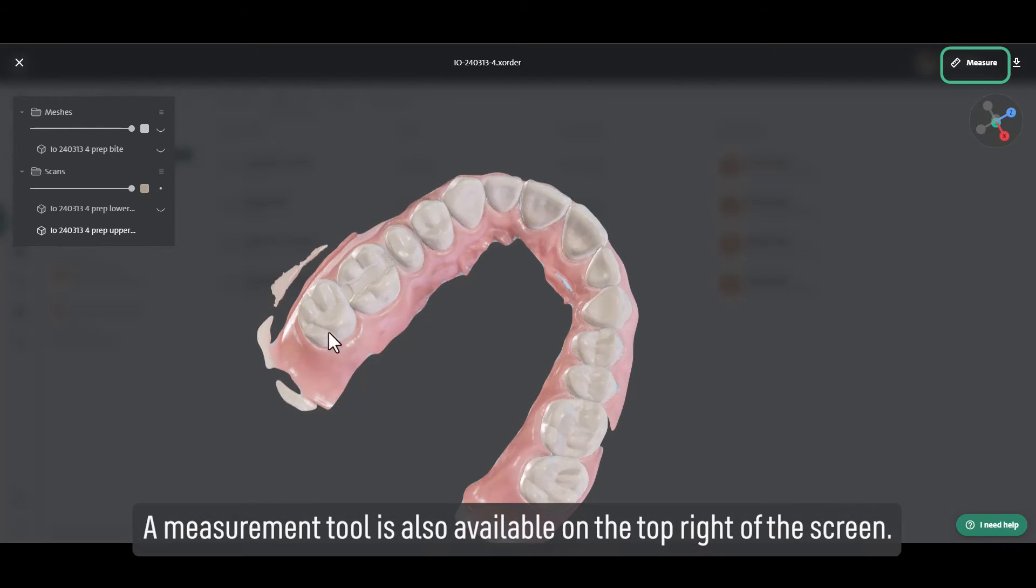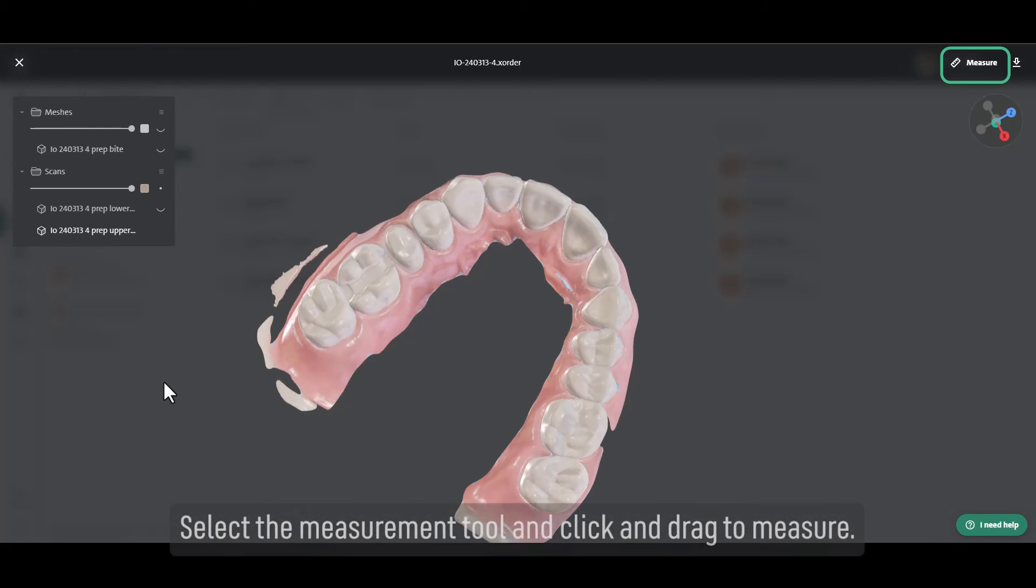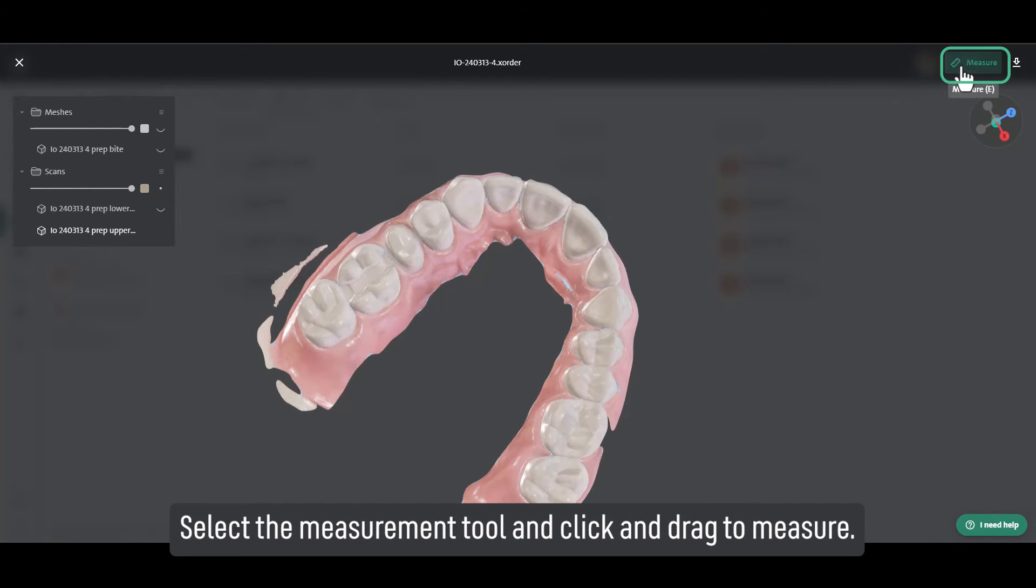The measurement tool is also available on the top right of the screen. Select the measurement tool and click and drag to measure.